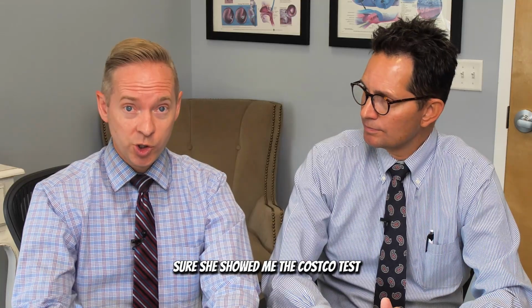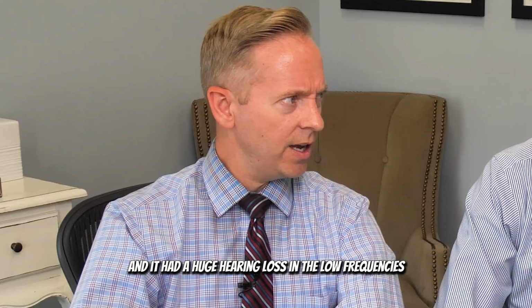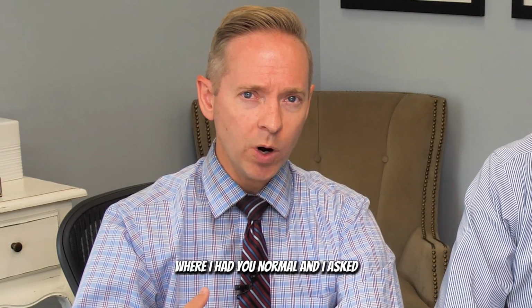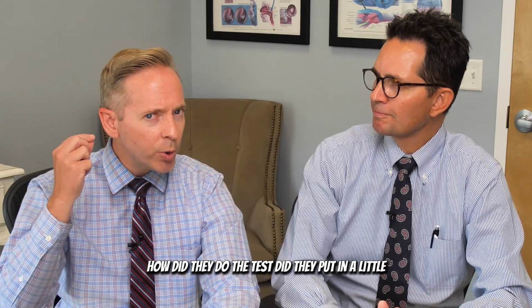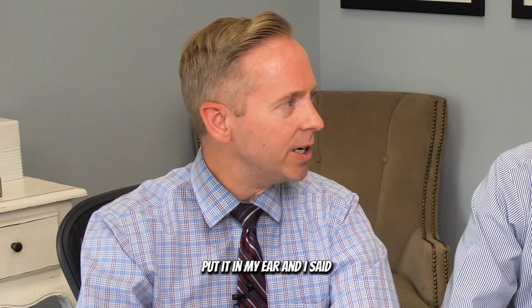She showed me the Costco test, and it had a huge hearing loss in the low frequencies. And I said, well, that's kind of odd that they're showing a big hearing loss here where I had you normal. And I asked, how did they do the test? Did they put in a little earbud in your ear? And they said, oh yeah, they put in just this little earbud, put it in my ear.